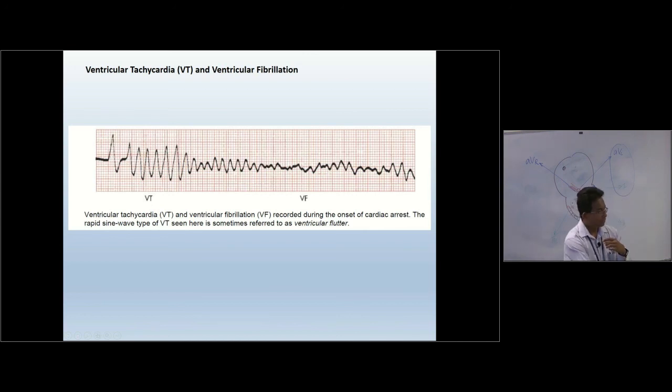All right, if you don't have any questions now, we have a couple of worksheets on your table. You might work through them, and the laminated sheet has various abnormal ECG tracings with abnormal pathologies. We will come around, and if you have any questions, we can clarify them. Thank you.